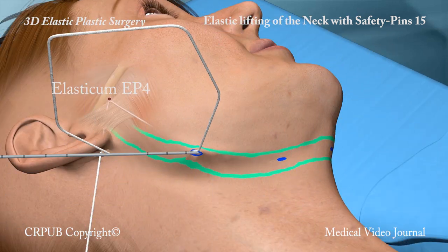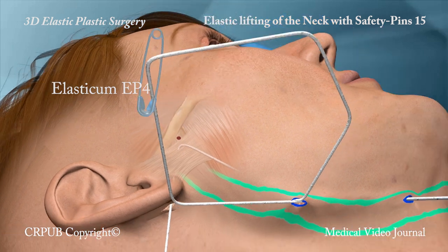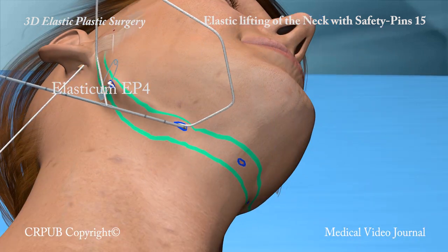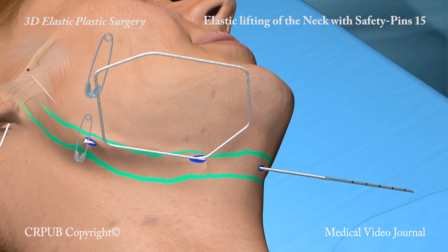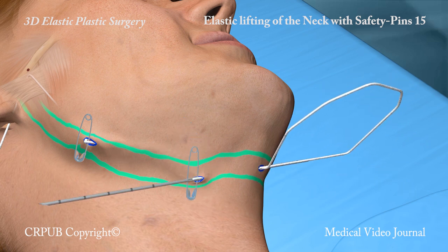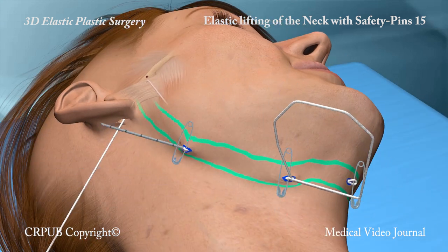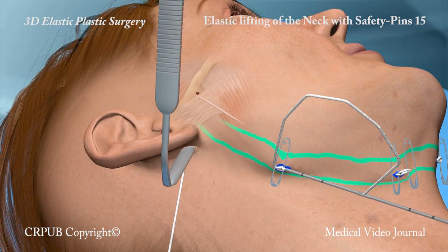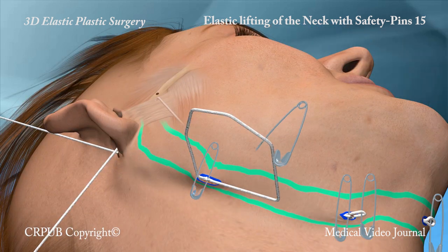The Jano needle is now rotated again and partially emerges from the second small lateral incision. The second safety pin is now used. The Jano needle is rotated laterally and partially emerges from the small incision. A safety pin is inserted into the loop formed by the elastic thread.